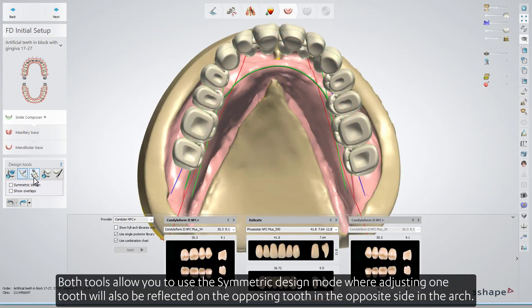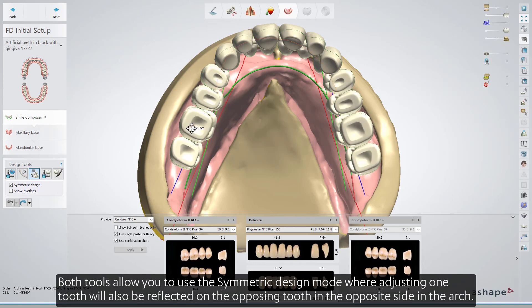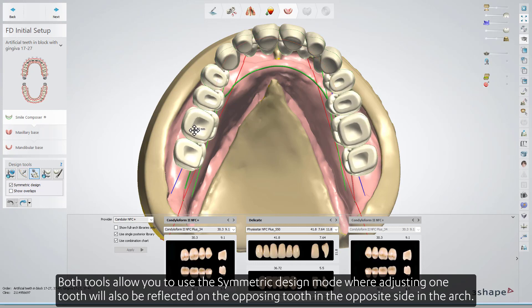Both tools allow you to use the symmetric design mode, where adjusting one tooth will also be reflected on the opposing tooth on the opposite side of the arch.